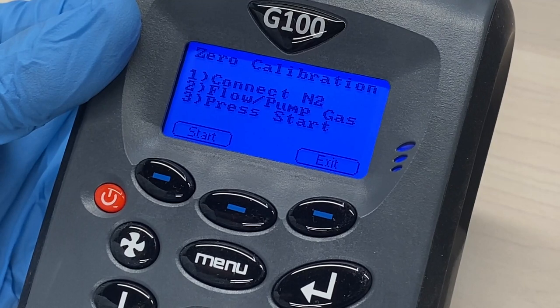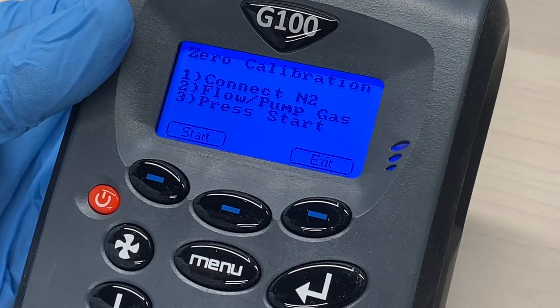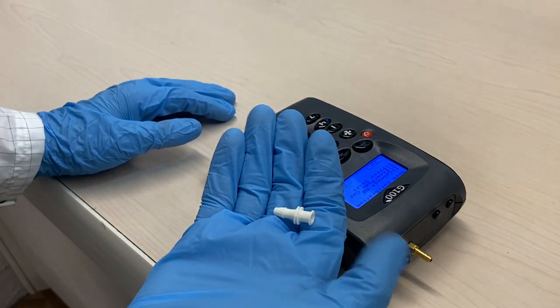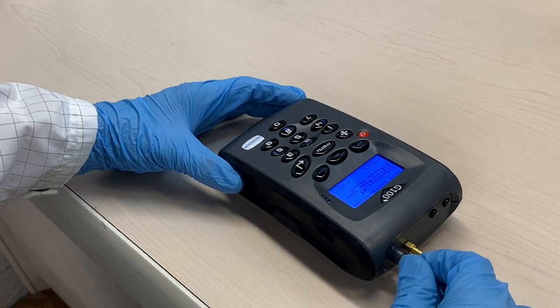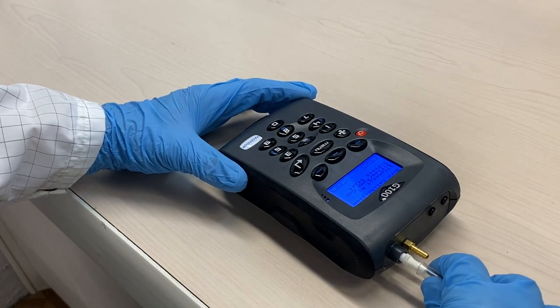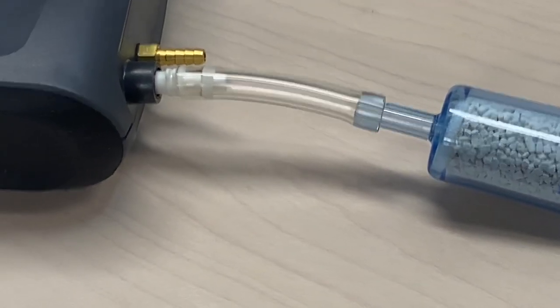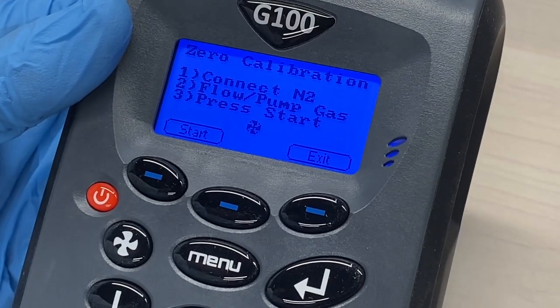Follow the instructions on the instrument display. The first step states to connect a nitrogen gas, but in this case you will use the SodaLime filter. Connect the SodaLime filter to the gas inlet of the instrument.